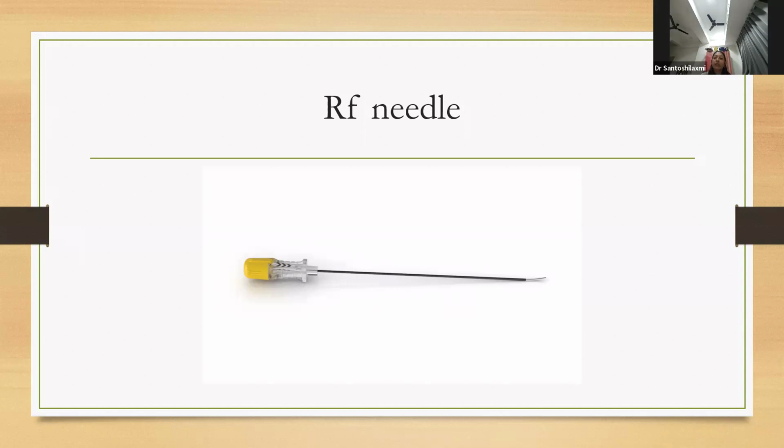Radio frequency ablation, sir. Okay, so radio frequency ablation, and you can talk about the different radio frequency ablations. Genicular ablation. Okay. Trigeminal nerve. Okay. Medial branch RF. Okay. Facet medial branch block, that is medial branch. Okay, yes. SI joint, SI joint also. So any of the nerves, any of the joints can be ablated. Yes, there are different methods to ablate that, but you can do that, right?